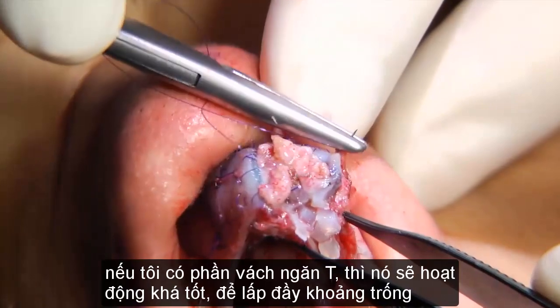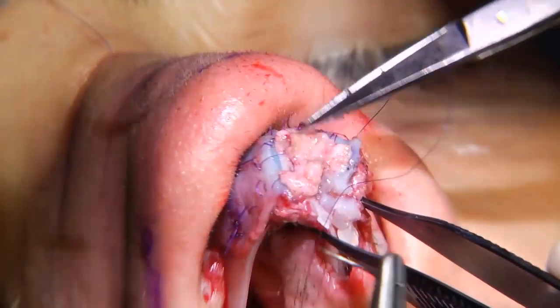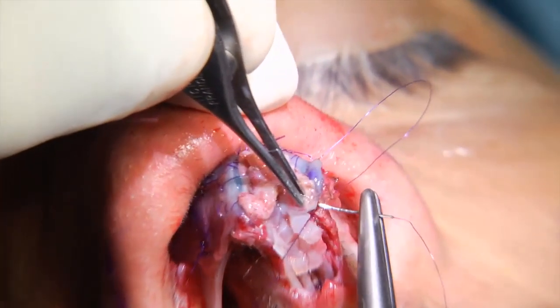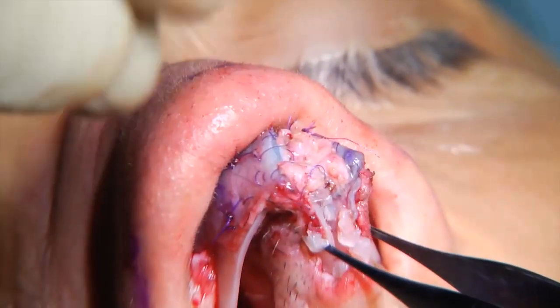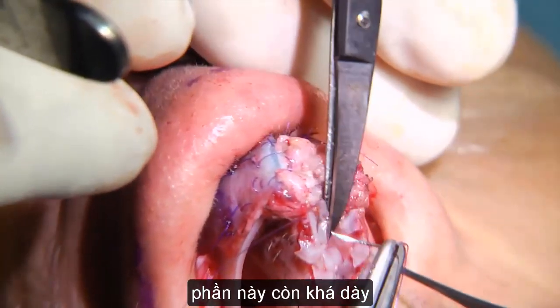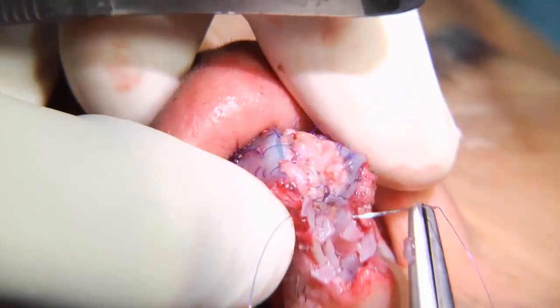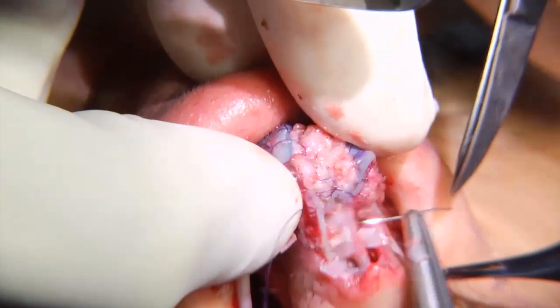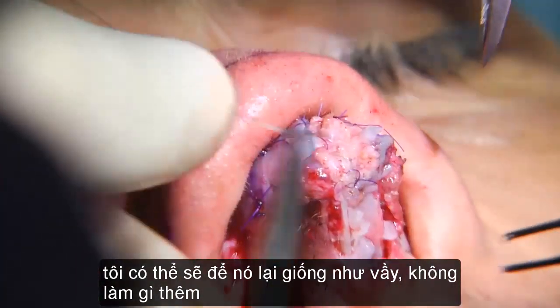So if I had the septal cartilage, it would work pretty well to fill this space. It's just too thick, this thing. I probably will just let it go like this without anything else.